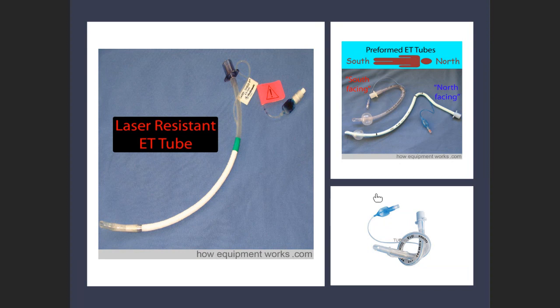So we use special tubes when we need special situations. The most common special tubes that you'll come across when you come to clinics are south facing or north facing tubes. There are others. So if we're doing laser surgery, like they're cauterizing using laser on the larynx, you need a special tube so the tube doesn't catch fire or melt and you lose the airway.